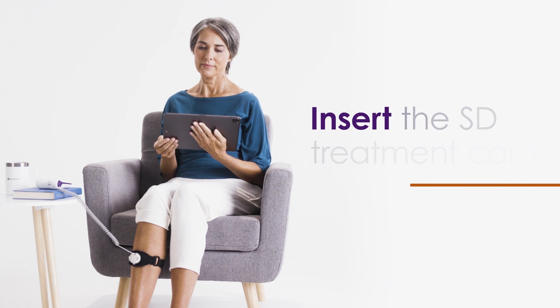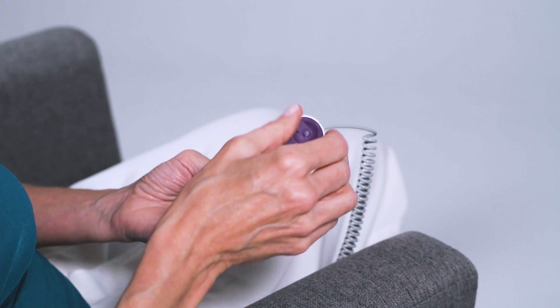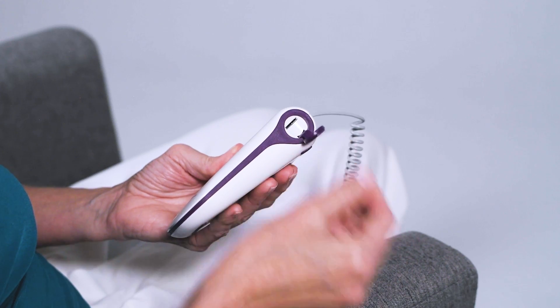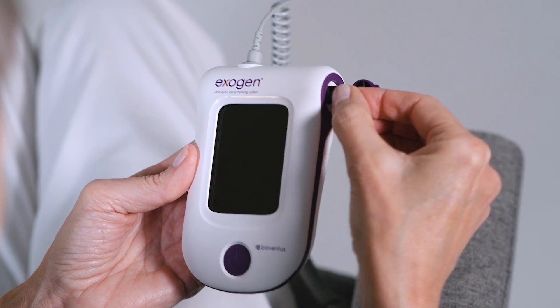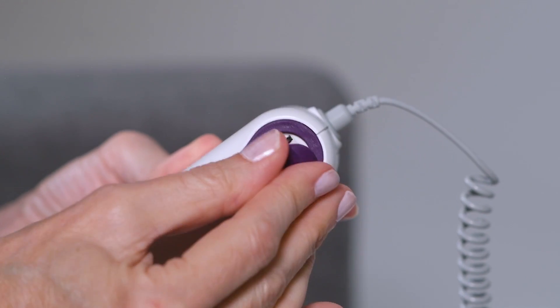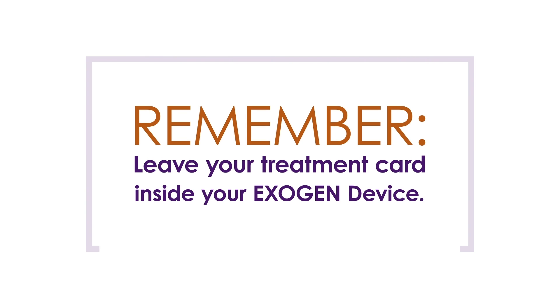Before beginning treatment, you need to insert the SD treatment card. To do this, open the cover on the right side of the device. With the metal contacts facing up and entering first, slide the card into the port. Press the card until it clicks into place, then close the cover. Remember to leave the treatment card inside your Exogen until you have completed all of your treatments or until you have used all of the treatments programmed into the device.